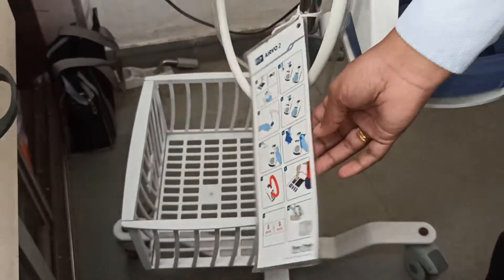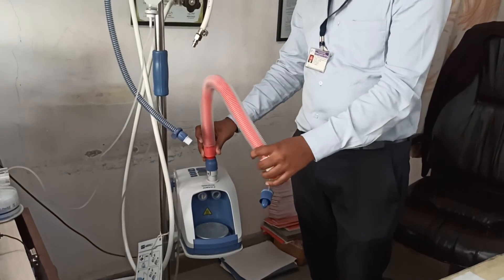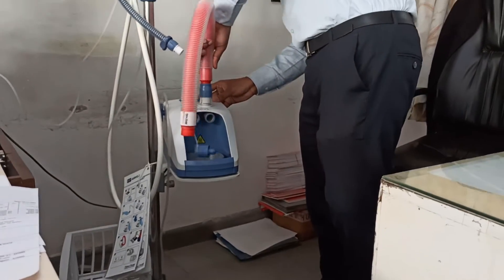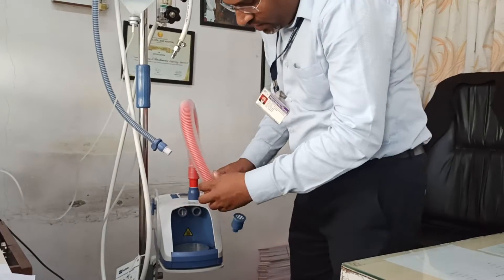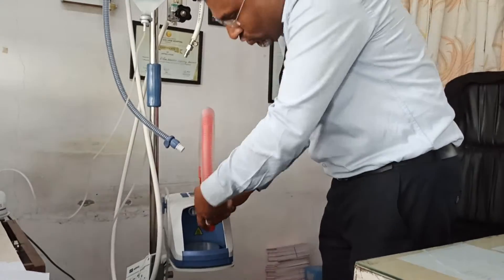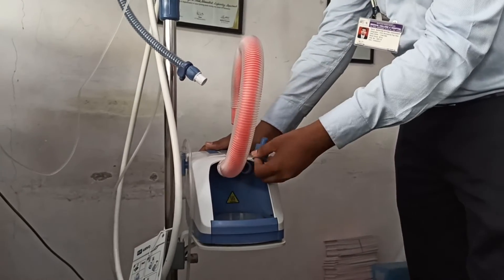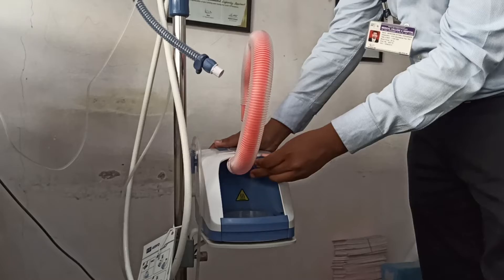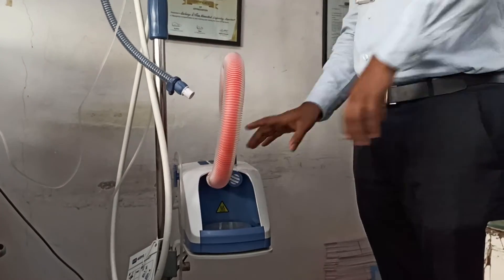First you have to connect this one — make it lock. You have to connect this at the left side. There is a blocker which you have to connect at the right side.